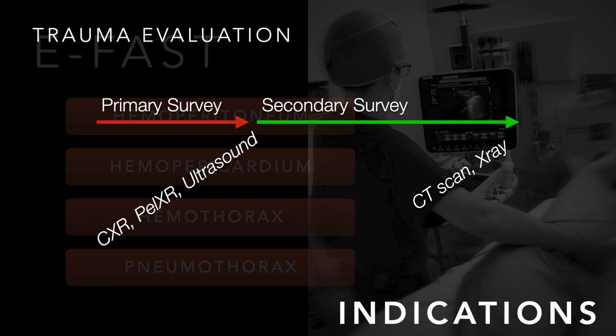And so we talked a little bit about that paradigm, how it replaces the DPL, how it could be a useful adjunct to the primary survey, and how it doesn't necessarily supplant further workup for other injuries. So that's the big picture philosophical thing.